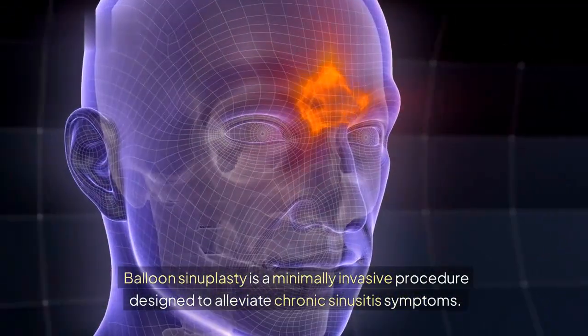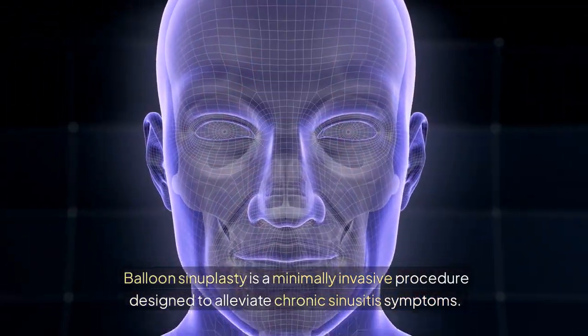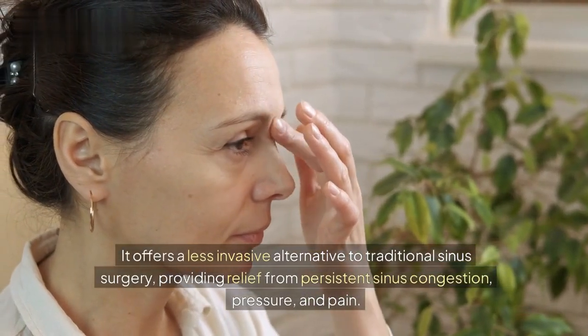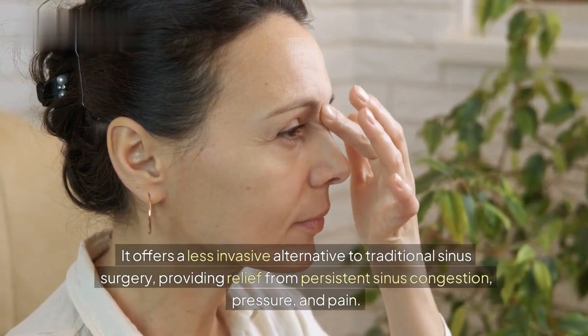Balloon Sinuplasty is a minimally invasive procedure designed to alleviate chronic sinusitis symptoms. It offers a less invasive alternative to traditional sinus surgery, providing relief from persistent sinus congestion, pressure, and pain.